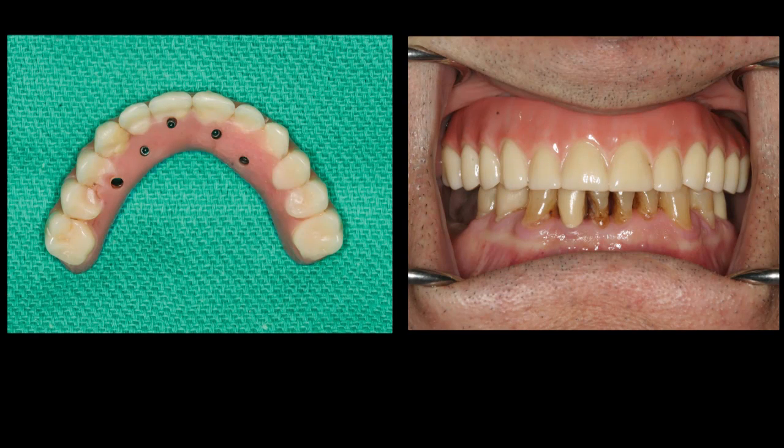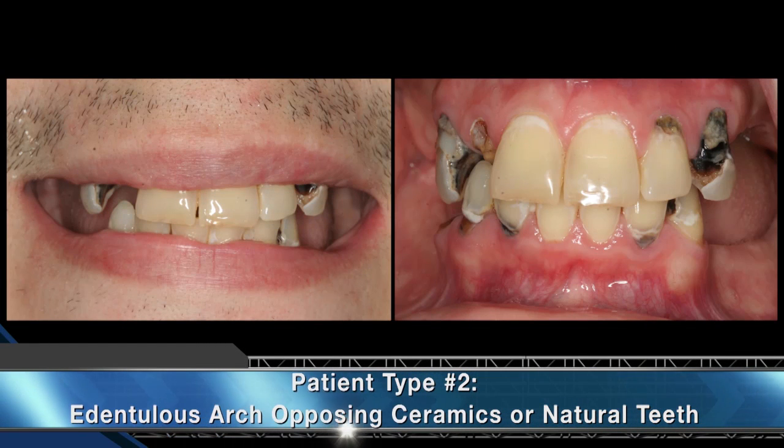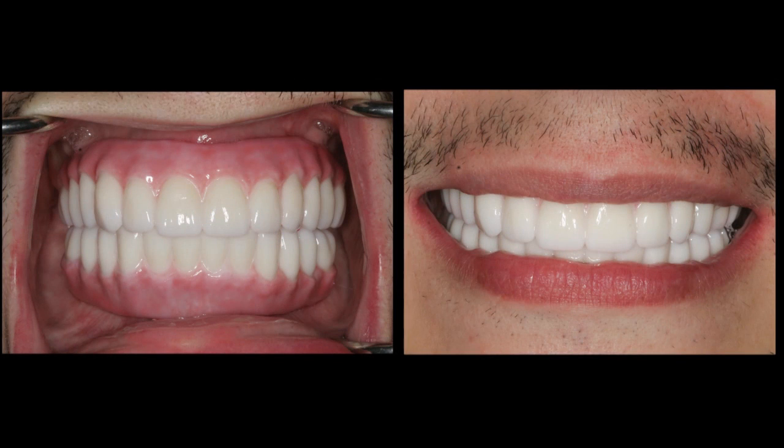A 45-year-old patient presenting with dentition that had deteriorated beyond the point of conventional restoration and thus required replacement. Notice the numerous missing teeth and significantly carious remaining teeth. The treatment protocol for this type of patient aligns with that of the acrylic hybrid denture. A minimum of four implants are placed following the clinician's surgical protocol of choice for a fixed full-arch implant prosthesis, taking care to achieve sufficient anterior-posterior spread.